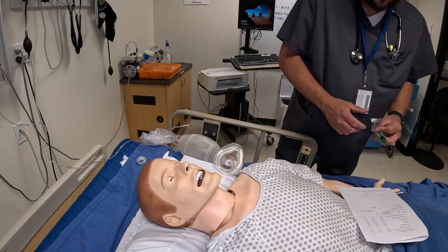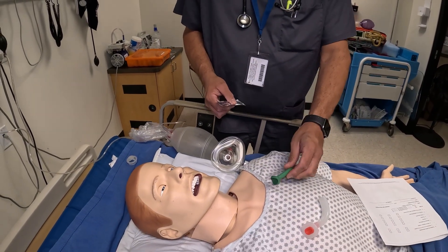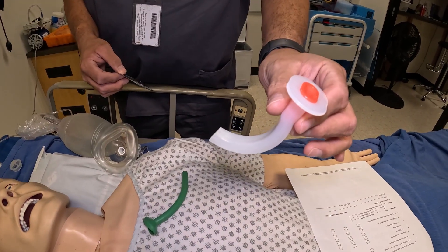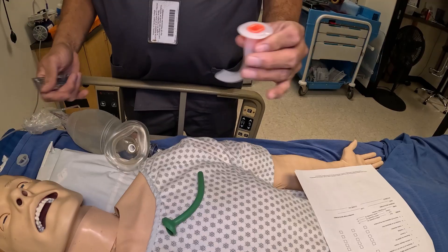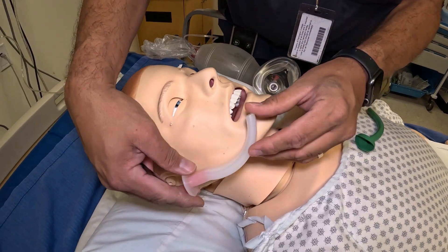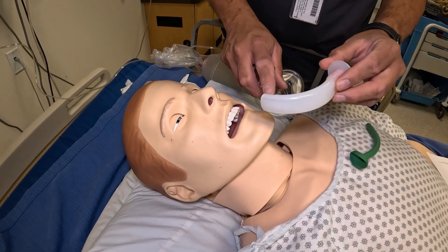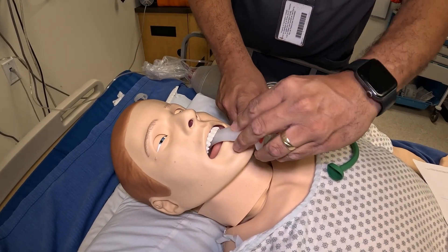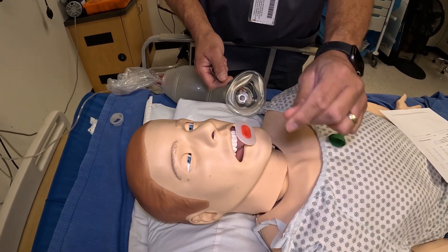Before placing the mask on the patient, I'll cover the NPA (nasopharyngeal airway) and OPA (oropharyngeal airway). Never use an OPA in a conscious patient — it will cause a gag reflex and potential vomiting. For demonstration, let's pretend the patient is not awake. Measure the OPA from the jawbone to the mouth. Insert it on an angle — some rotate it upward and turn around; that's your preference. It also allows suctioning down the middle or from the sides.